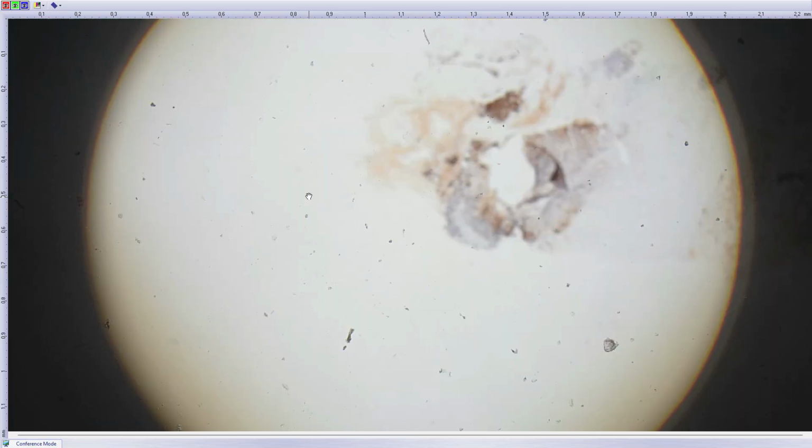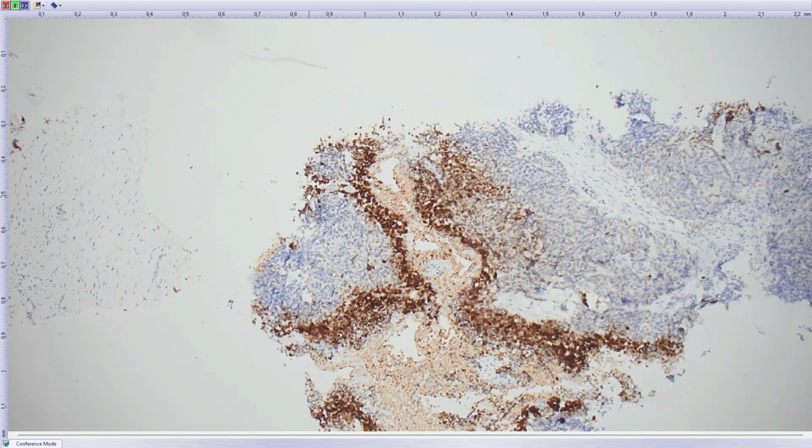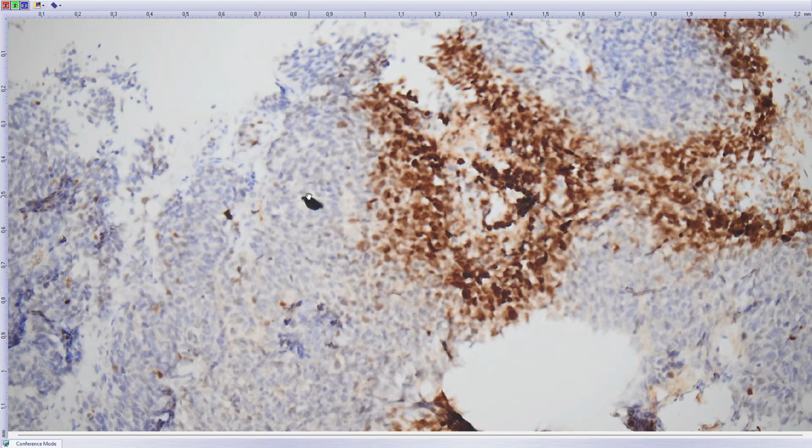I also did DUX4 immunohistochemistry for CIC-DUX4 sarcomas, cytokeratins, neuroendocrine markers, MyoD1, all that was done by the submitting pathologist. And I also added DDIT3, which is a marker for myxoid liposarcoma. This obviously doesn't look like a conventional myxoid liposarcoma, but there is a high-grade variant, which is basically a small round cell tumor.